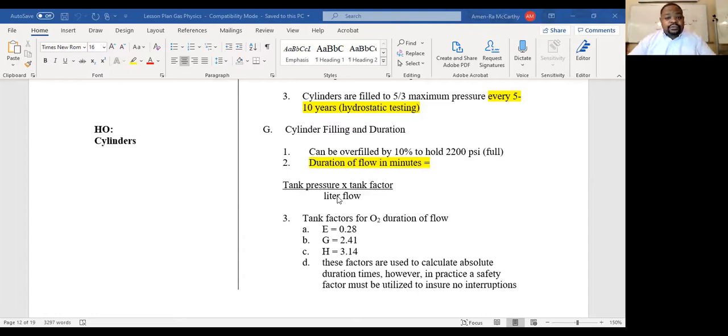If I put them on 2 liters and their sat goes up, then I leave them at 2. But if I put them on 2 liters and it doesn't go up, then I need to give them a little bit more. Put them on 3 liters, 4 liters. If that's not enough, let's scoot to a simple face mask. Non-rebreather, right? We start working our way up to get their saturation right. We're trying to give whatever amount of oxygen it takes to get them out of hypoxemia status, okay? If they're hypoxic, then we want to get them out of hypoxic status, okay? Because being hypoxic is very dangerous on the brain.